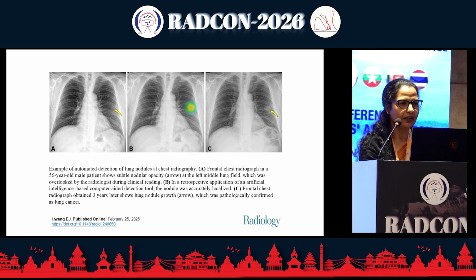Just one example, this is a radiograph of a 56-year-old male in which this opacity was overlooked by the radiologist, and when retrospectively the AI-enabled CAD was applied, it detected the opacity, and at follow-up after 3 years, the tumor grew in size, and pathology confirmed it as lung cancer. Sometimes AI is helping us, but we should also be equally good in interpretation.